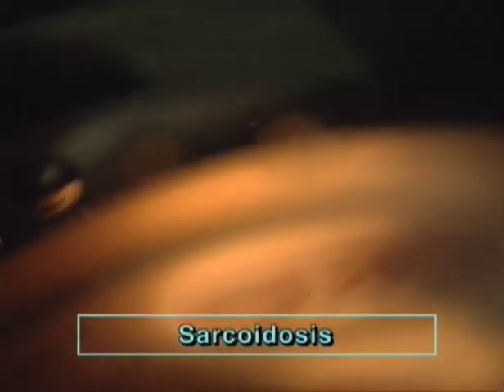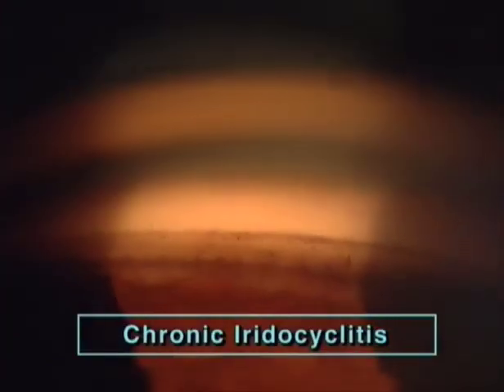In this other case of sarcoidosis, the oblique distortion of the iris adhesions points to their inflammatory origin. And in this case of chronic iridocyclitis, the post-inflammatory nature of the adhesions is indicated by the chaotic directions of the tissue strands. Compare the inflammatory with the mechanically induced synechia.